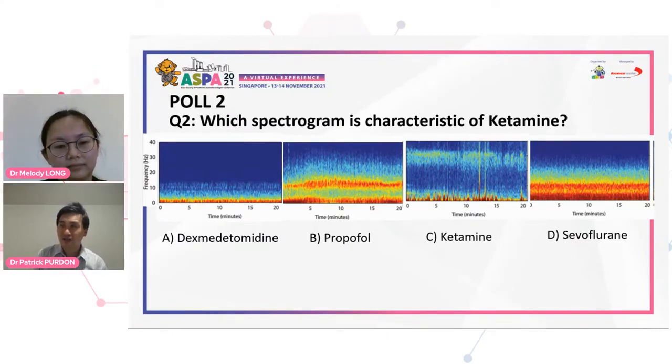Another point along in that direction is that in older adults, I think it's fairly clear now that the current BIS algorithm tends to do a poor job of reading older adults, because the older adult EEG is much smaller than, say, a younger middle-aged EEG. And the patterns are still the same, but it's just so much smaller that the algorithm is often fooled into making the monitor read a bit higher numerically, and thus causing, in some cases when the patients are really old or maybe impaired cognitively, so they have a small alpha wave, sort of encouraging anesthesiologists maybe to turn up the dose and push them into burst suppression.